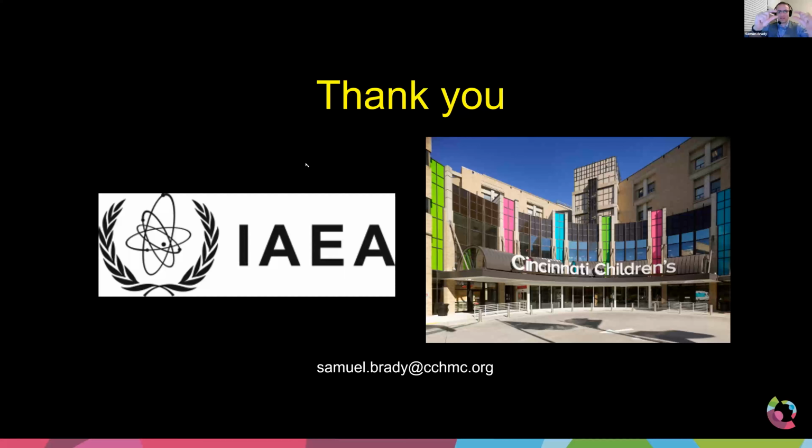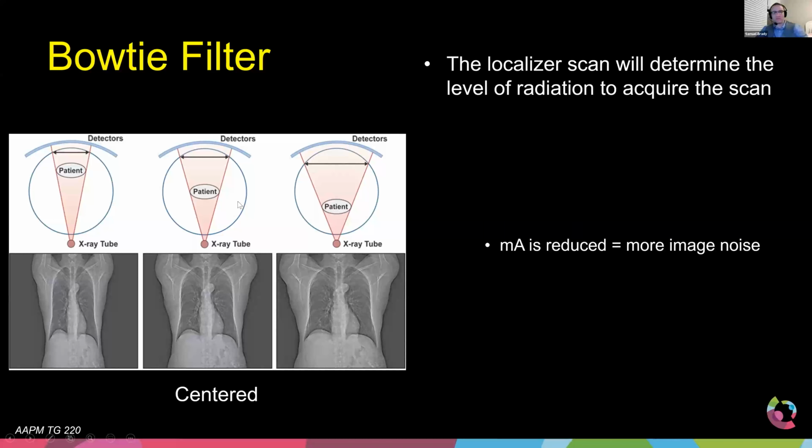So in that one slide, if you always consider, let me see if I can go back real quick. Nope, sorry, wrong one. There we go. All right, you should be able to see my screen now. So the patient is always with respect to the tube. Depending on where you start, if your tube in this case is below the table and the patient is lower, then they would still be magnified. So yes, thank you, Panyutai, for pointing that out.